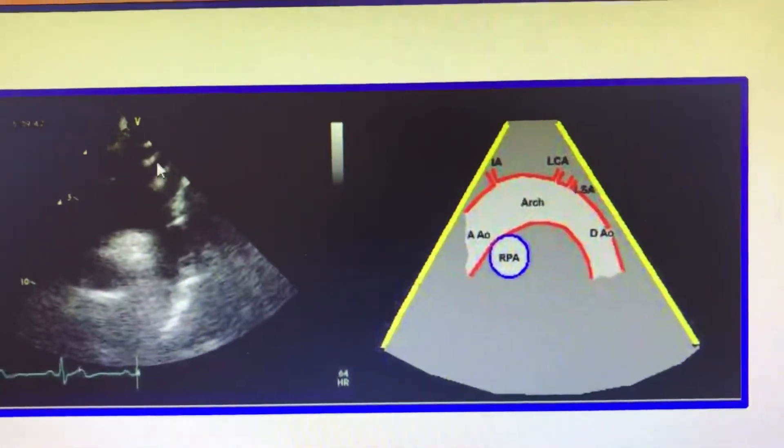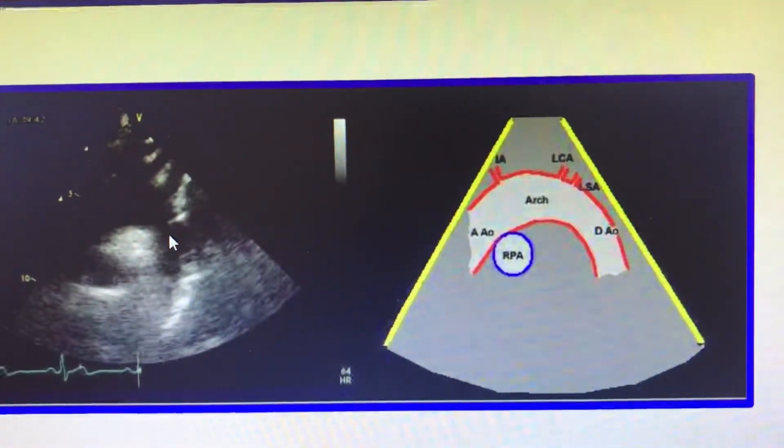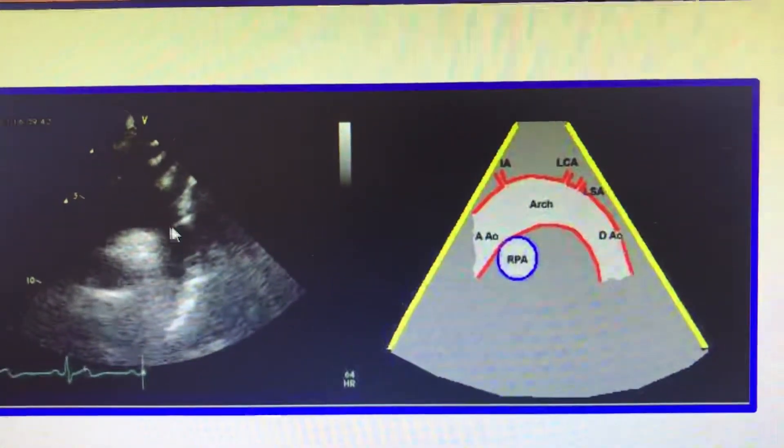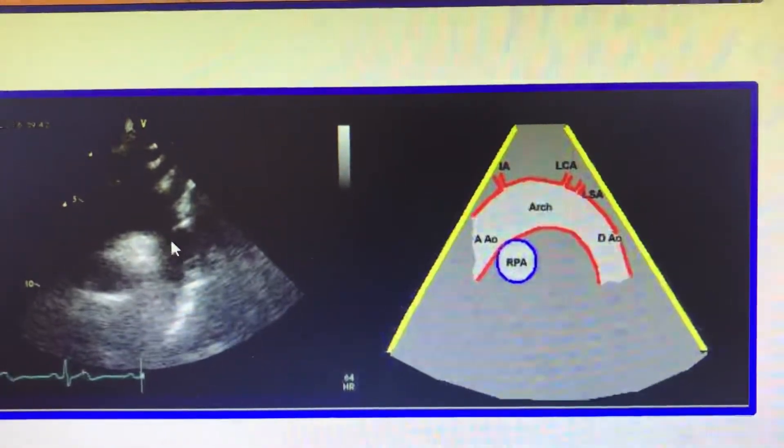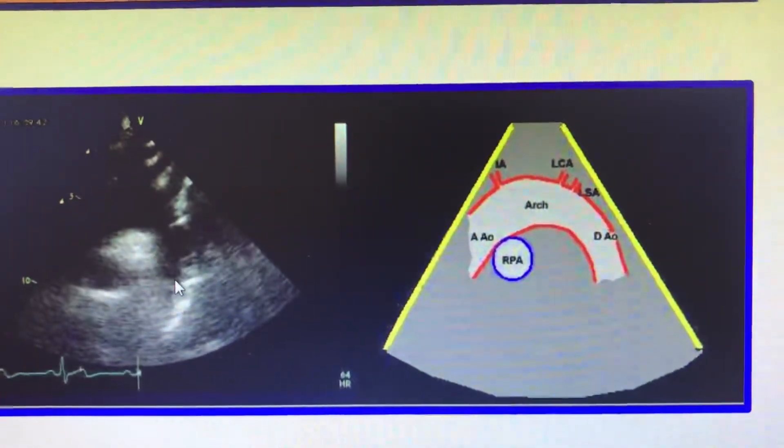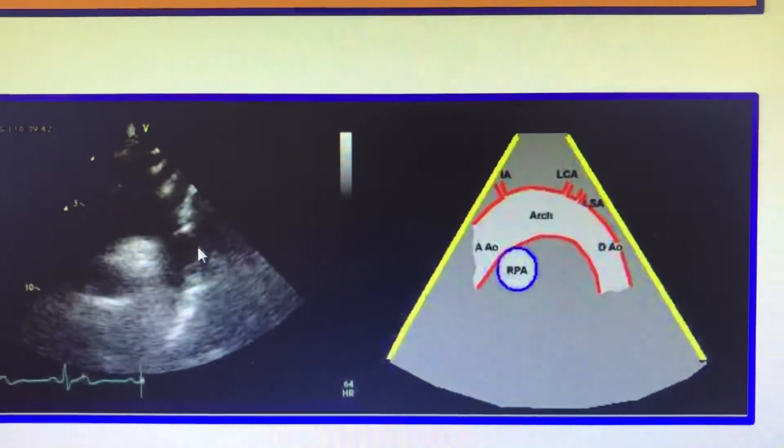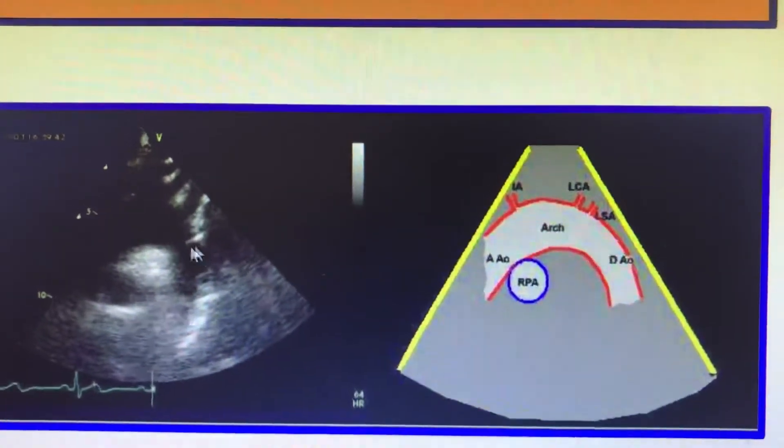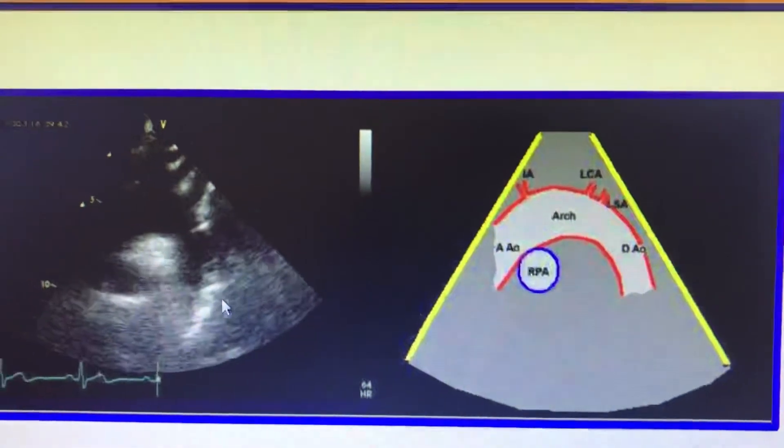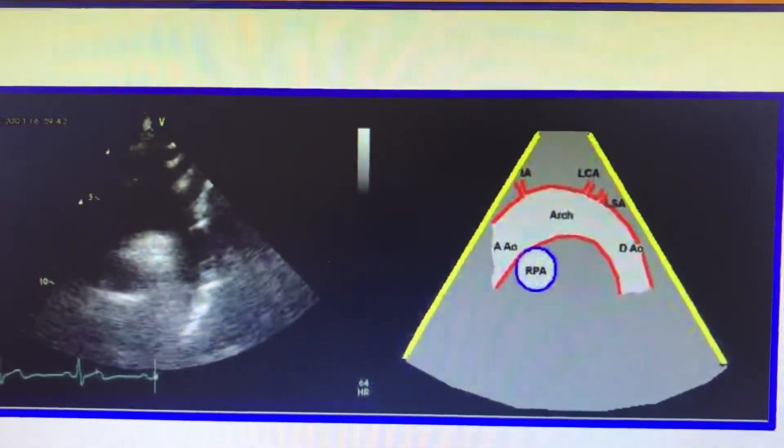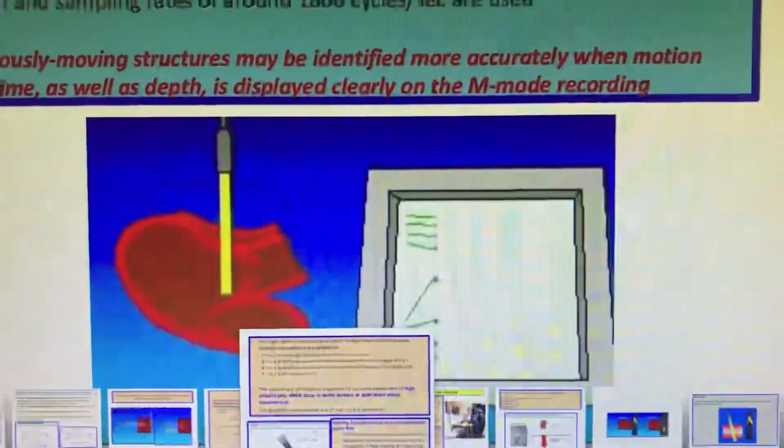If you put the Doppler here and take the continuous pressure gradients, you can assess the turbulence. With color Doppler, turbulence will be there, and you can record the continuous pressure gradients. If it is more than 20 to 25 millimeters, then interventions may help relieve the pressure the LV is under. Thank you.